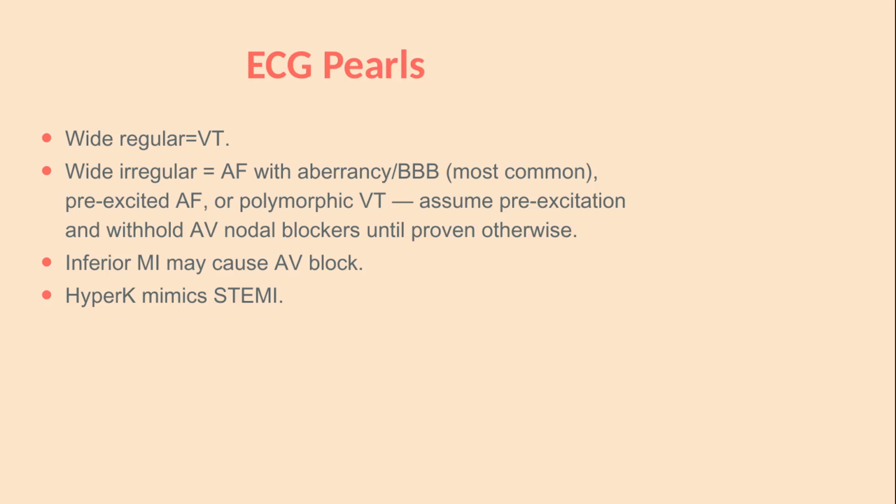Fourth, hyperkalemia is the great imposter, capable of mimicking STEMI with pseudo-elevation, producing wide complex rhythms and flattening P waves entirely. In the renal patient with a strange tracing, give calcium first and argue about the differential afterward. Tape these 4 to the inside of your skull.